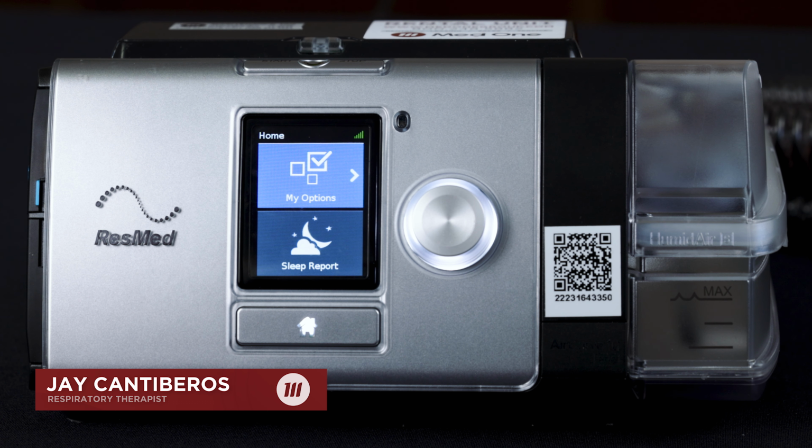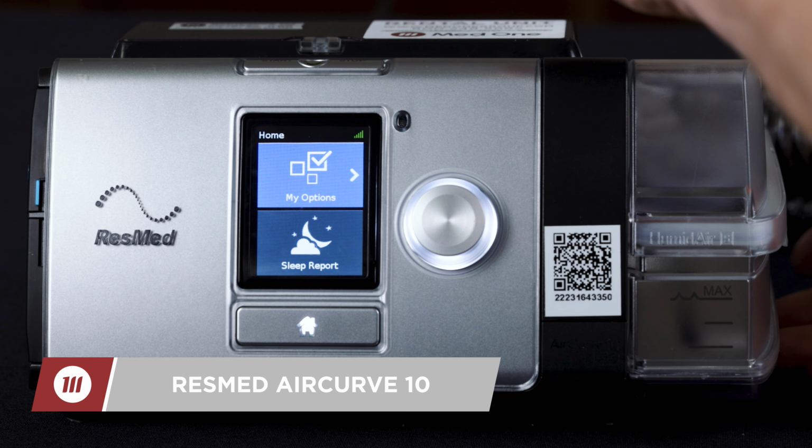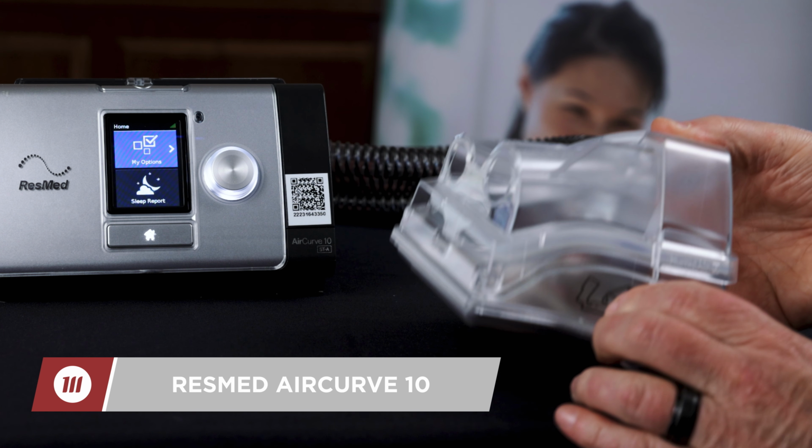I am a nationally registered respiratory therapist covering the ResMed AirCurve 10. The first thing I'm going to cover is the humidification chamber. This is for patient comfort.